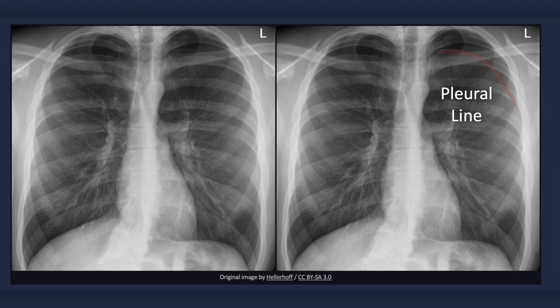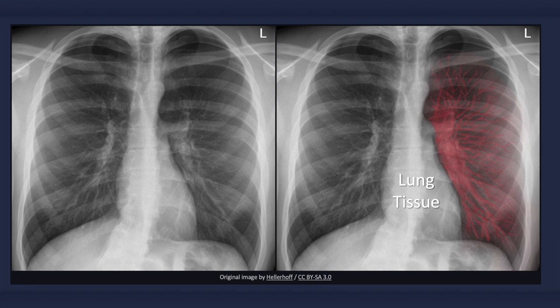If the lung is consolidated, then the visceral pleura won't be distinguishable as a separate line, but rather as the edge of the consolidation. Within the confines of the visceral pleural line you can see lung tissue, which can be identified by the presence of lung markings. The contralateral lung however may appear to have more prominent lung markings due to increased vascular flow.